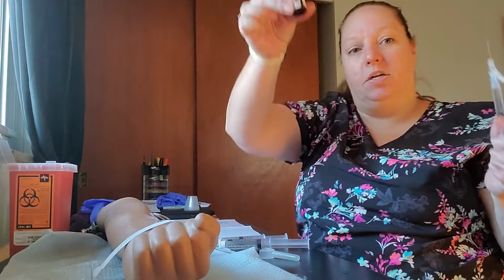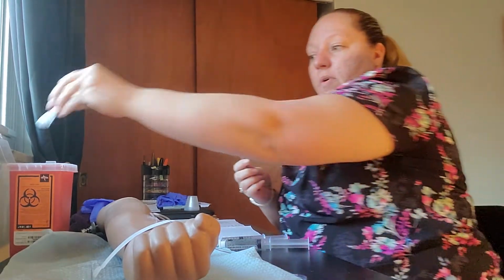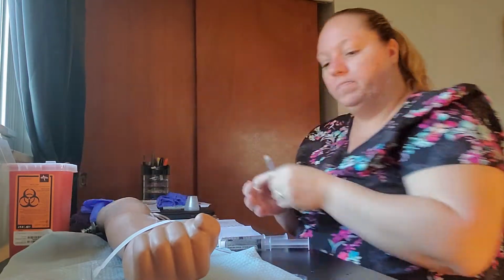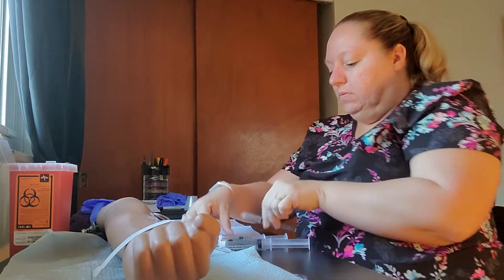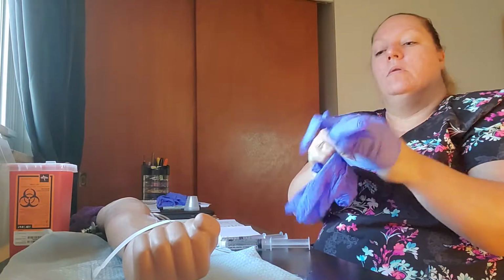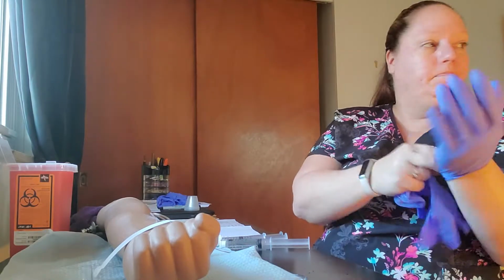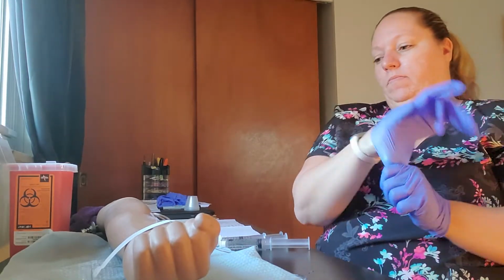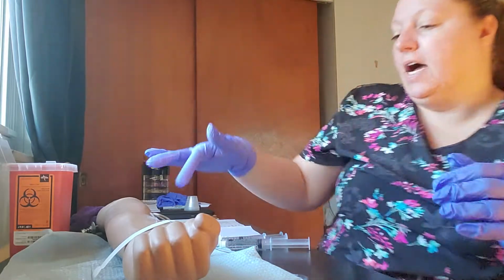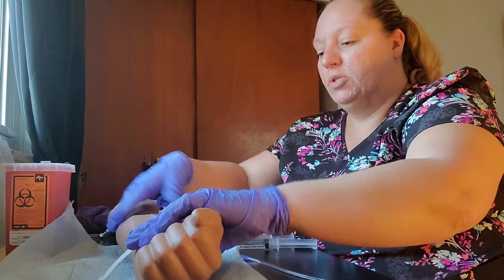take it out of there. This is going to go to the sharps container. I'm going to cap the needle and take this off, and this would also go into our sharps container. And then I'm going to put on my clean gloves. After I put on my clean gloves, I need to check my IV site to make sure it's running. IV site looks good. There's no redness, no swelling, no inflammation to the actual IV site here.